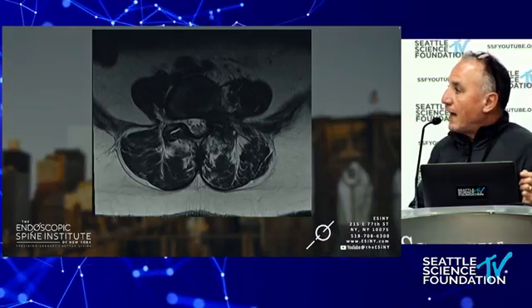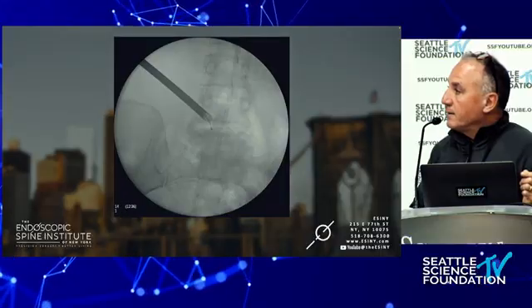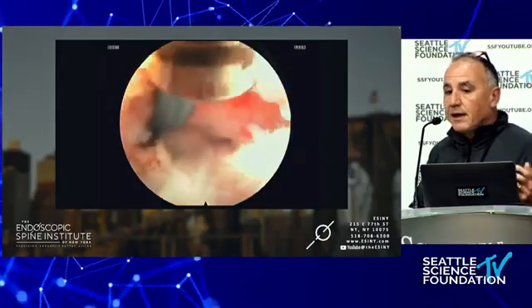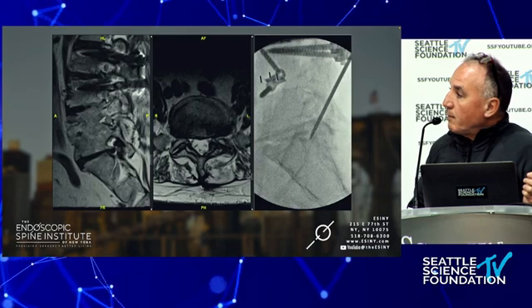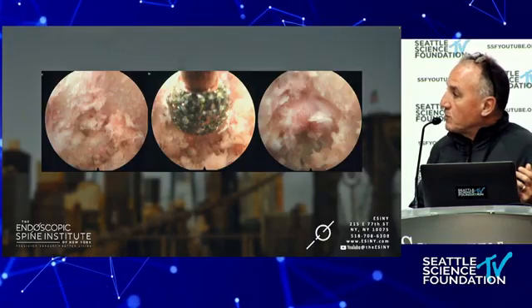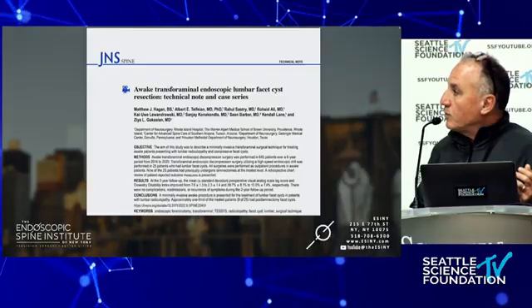Foraminal stenosis — this would be a great case for a lateral fusion; the foramen is completely occluded. There's the nerve root, there's the disc. I've opened up the foramen and elevated the nerve — all while chatting with the patient. This is a foramenotomy below a multi-level fusion, done awake with diamond drills. This is the starting foramen, and over here is after I'm done — you can see the exiting nerve root.